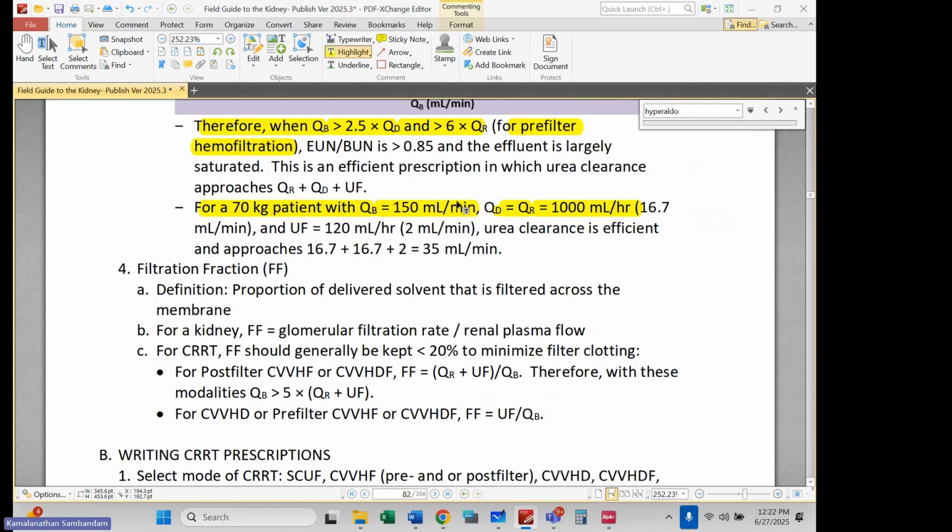That's because that arises because of these changes in units. If I take 1,000, divide by 60 to get to mils per minute, multiply times 6, the net mathematical operation is divide by 10, right?